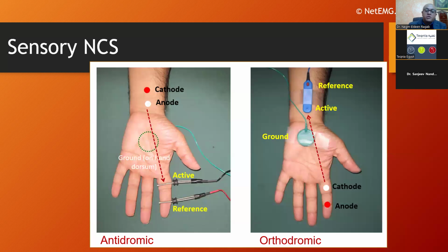Routinely, we use one shot in stimulating the sensory nerve, the peripheral nerve, so we get one single SNAP. We do not need proximal stimulation due to the high incidence of phase cancellation, as you know. But I think in some labs, we use distal sensory as well as proximal sensory. So what is the benefit from proximal stimulation in pathological cases?